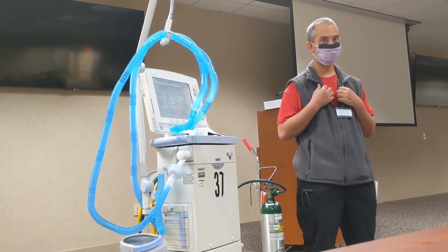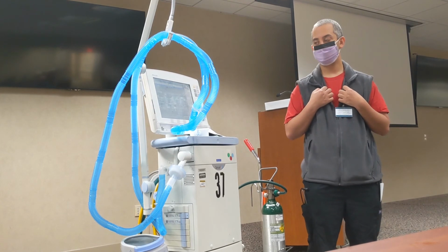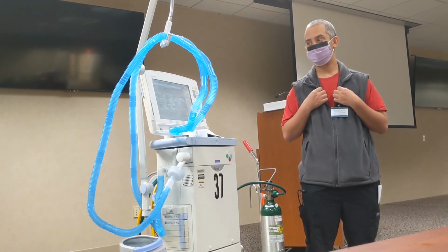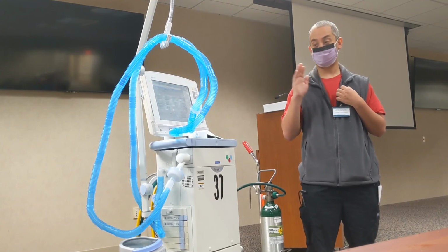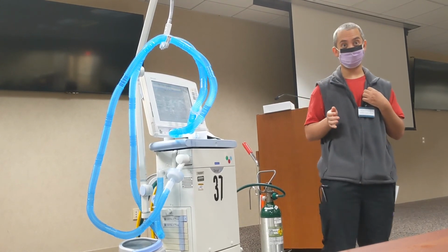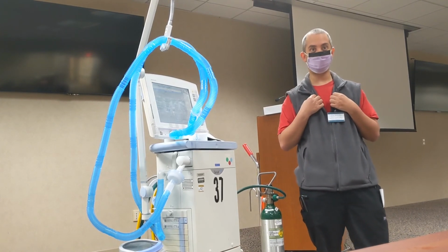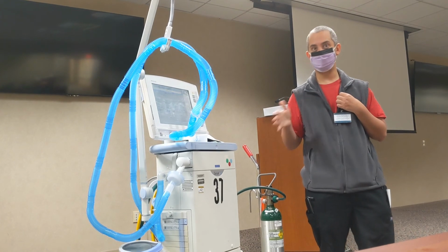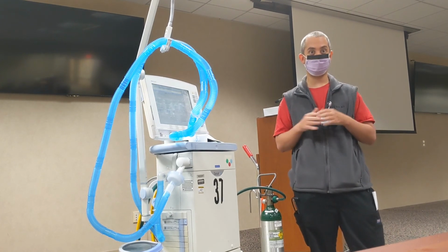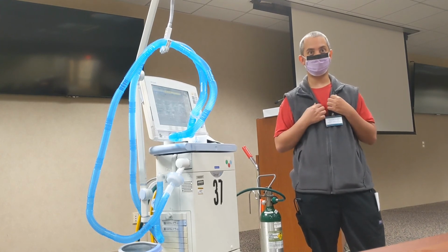And when changes are made, do you suggest waiting at least an hour to get the blood gas? Or does it depend on the patient? I'm a little fidgety about my blood gases. After putting them on it initially, then yeah, you definitely need something probably about an hour, because if you don't match your minute ventilation to what you were doing before, you do have the risk of making them really hypercapnic.